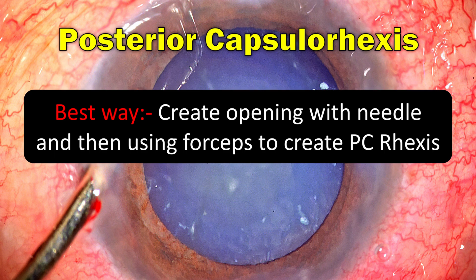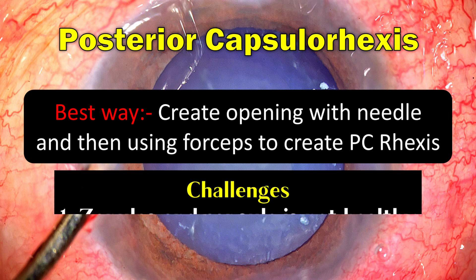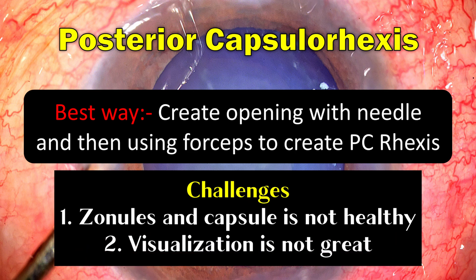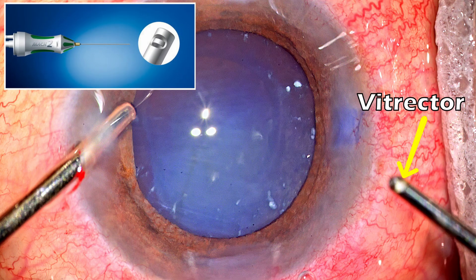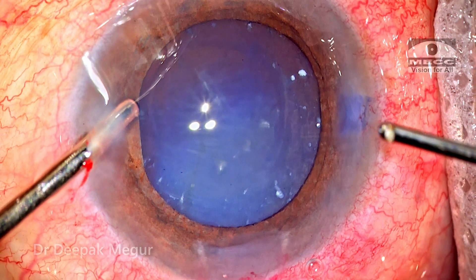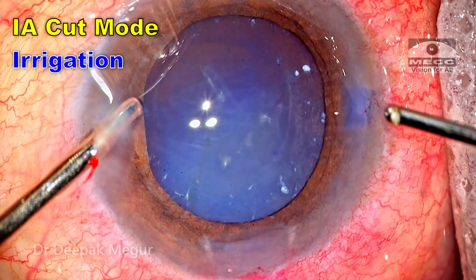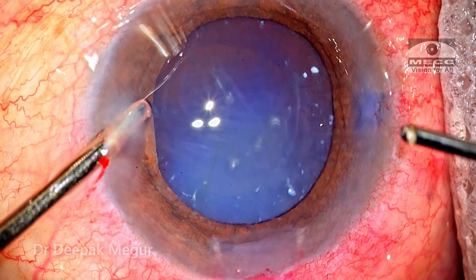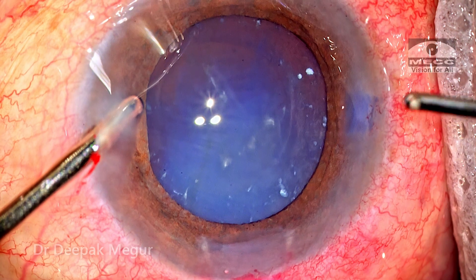The best technique is always to perforate with a needle and then use forceps, but there are a couple of challenges here. Number one, the zonules and capsule are not very healthy, so I'm not sure whether the tear will be controlled. The second issue is that visualization is not great. In such situations, my preferred technique is to use a vitrector to perform the posterior capsule rhexis. I'm going to use the IA cut mode — that is, irrigation, aspiration, and cut mode. The idea is to engage the capsule first with low vacuum and then start cutting.